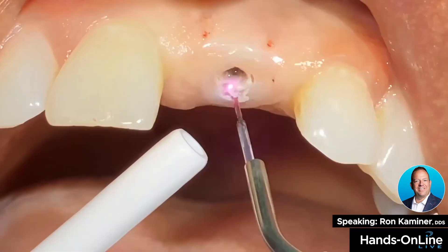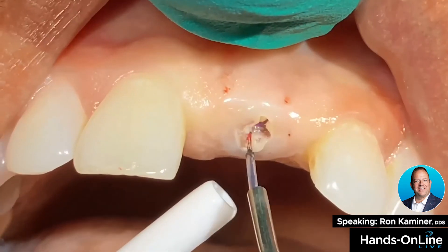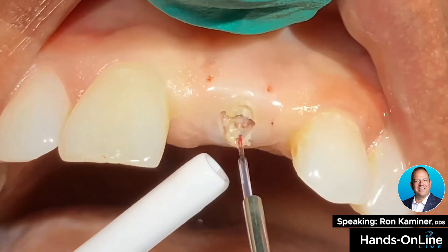We've initiated the tip at one watt. The patient has a little bit of anesthesia. You can see how readily the tissue opens right up.